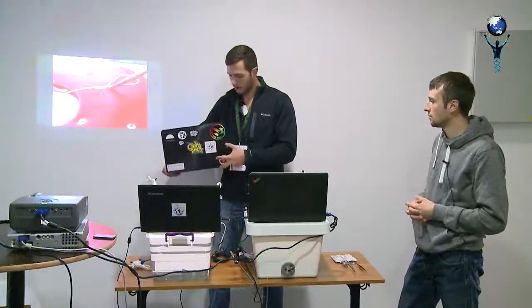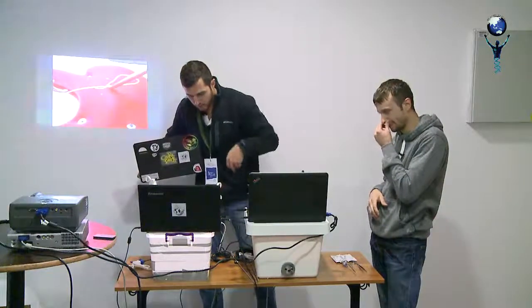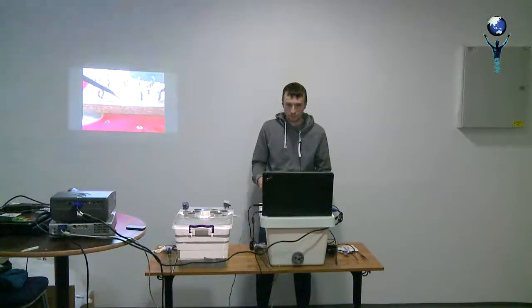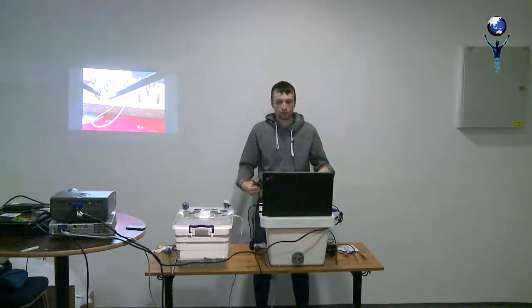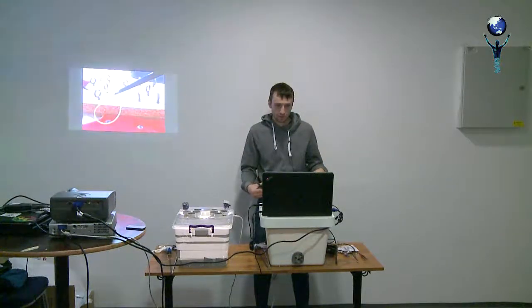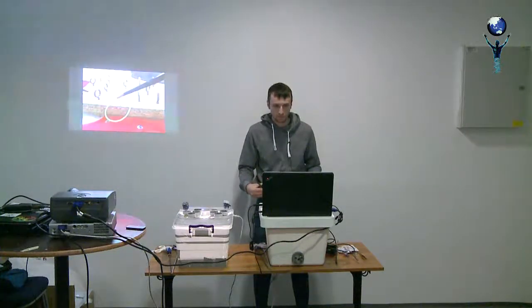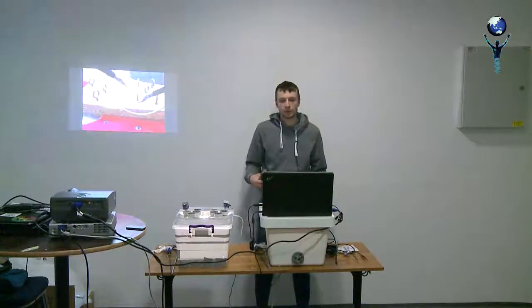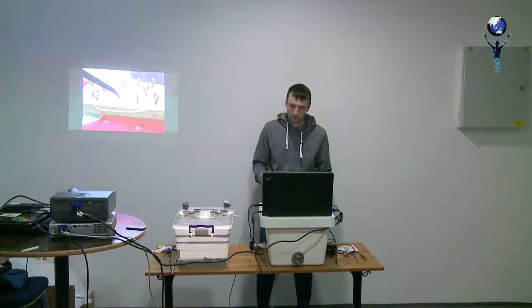So, first time. Anyone? And try to coordinate your hands and put it in these little holes in different ways, one by one. It's not an easy job. Like this. Then you try in another hole maybe.